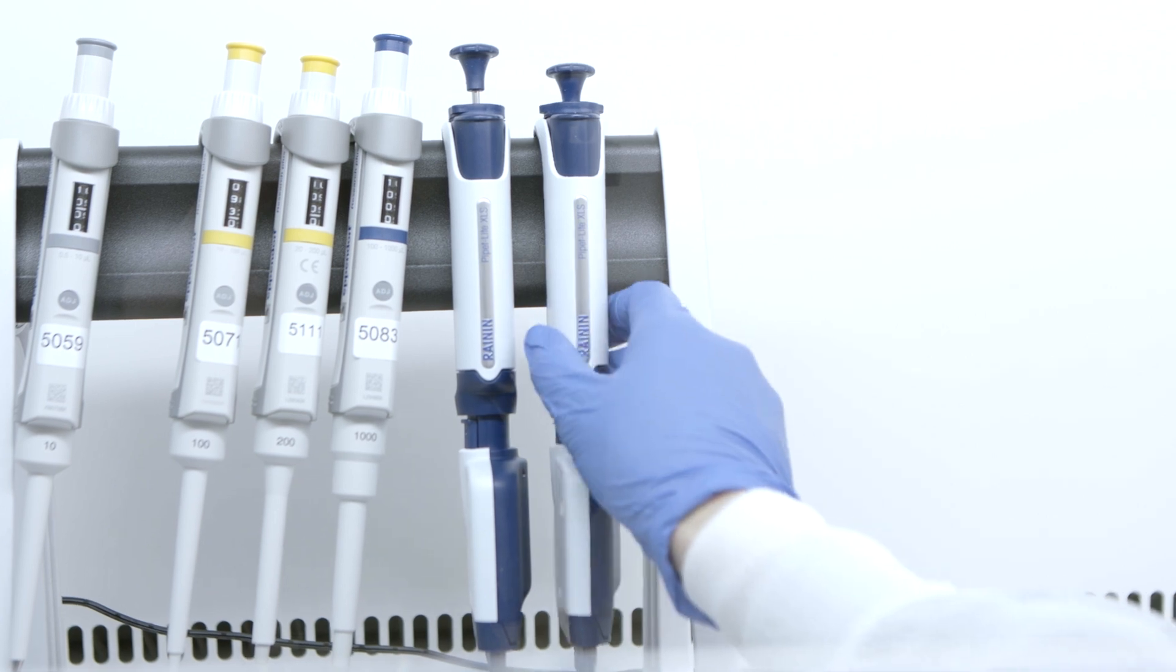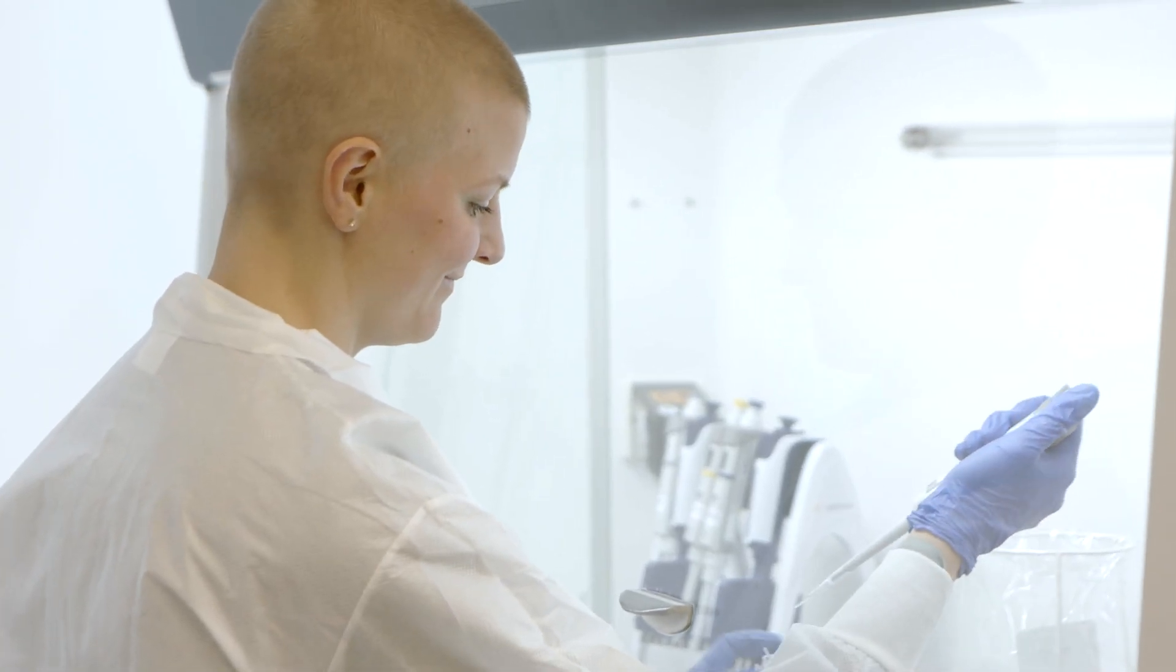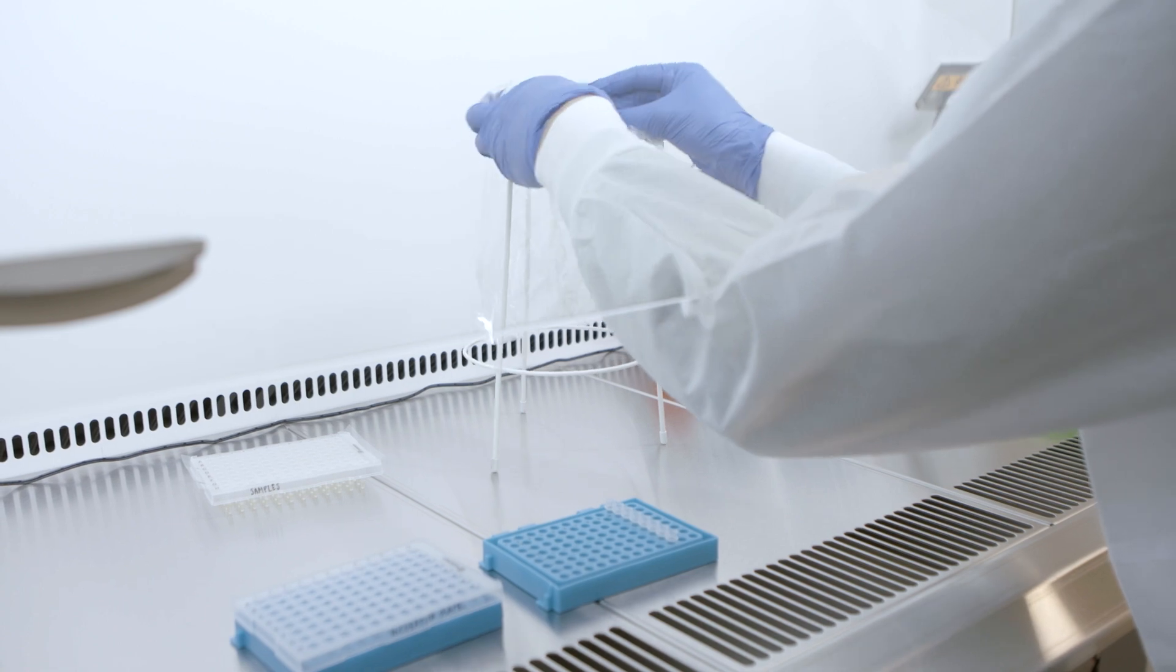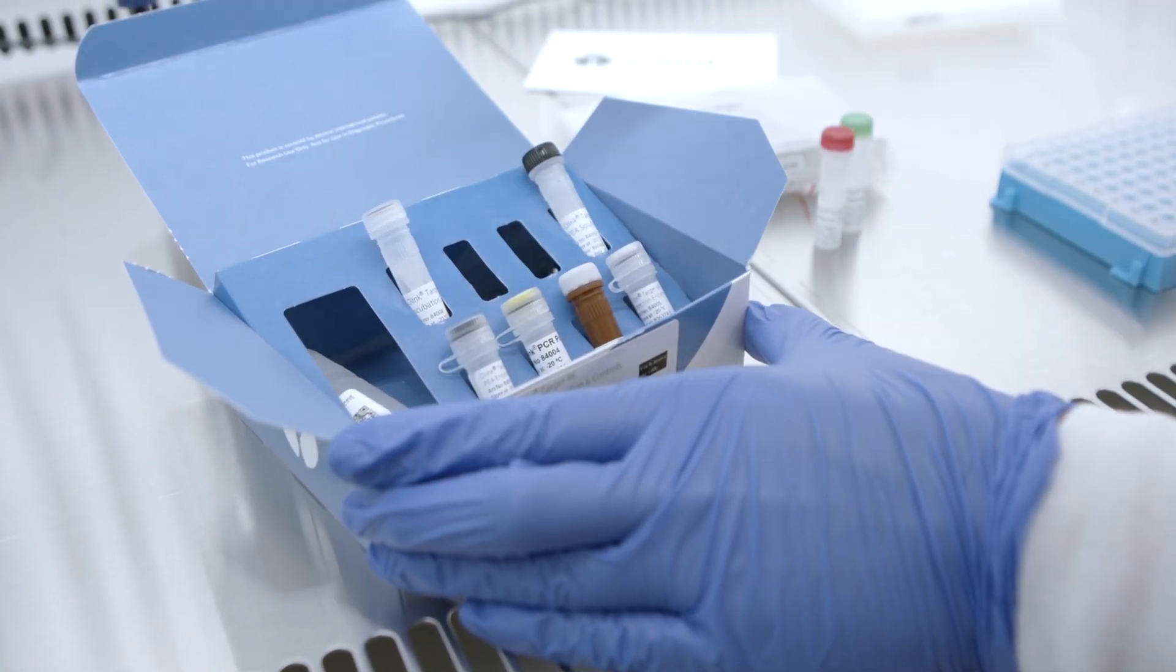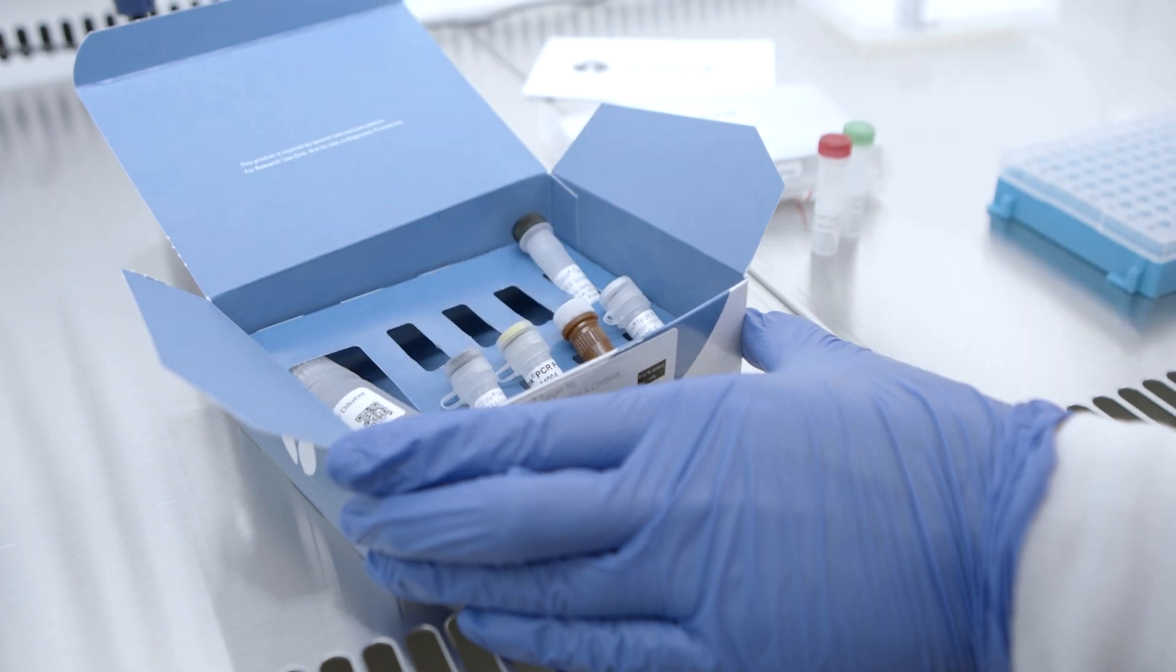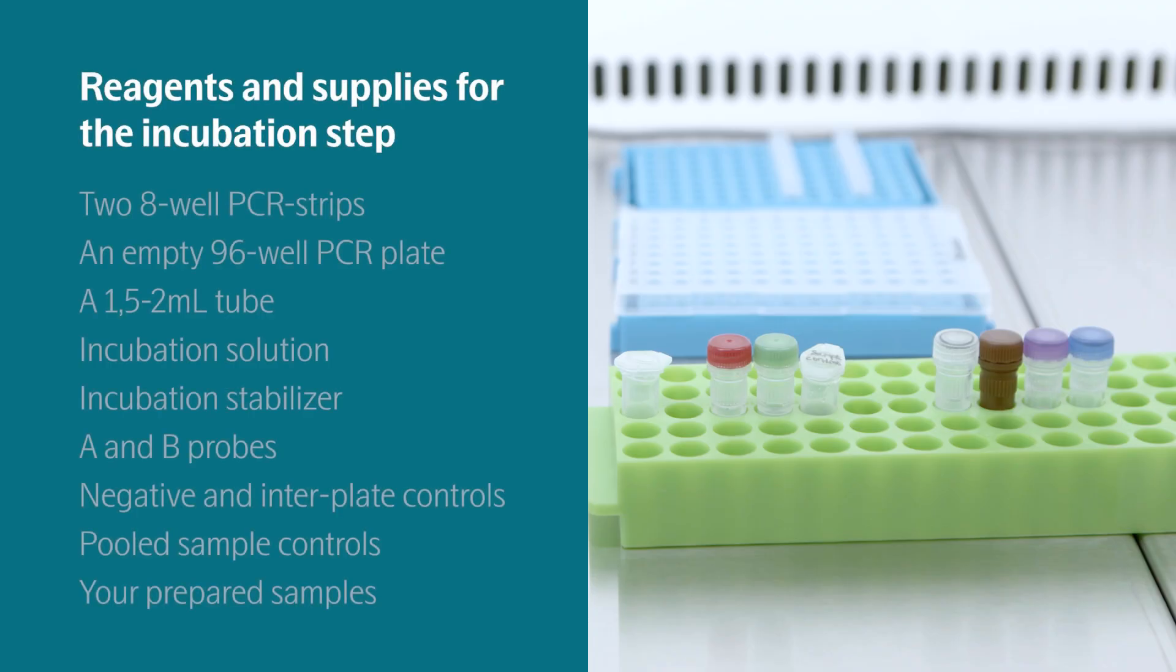Start by preparing your lab space with the necessary consumables and labware. Bring all reagents and controls, as well as the plate containing the samples, to room temperature before proceeding. Presented here are the required reagents and supplies for the incubation reaction.